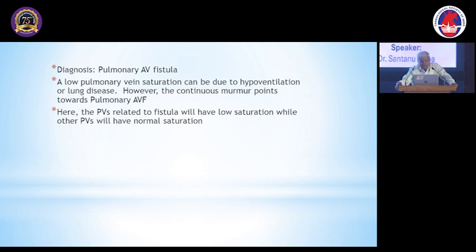This one. A 23-year-old female with recent onset palpitation and dyspnea. This is an interesting case. Somebody from this table should respond. Anybody? RA is high. RA saturation is 86. Otherwise it looks like an ASD. Is it an ASD? If yes, why? If no, why? Come on.